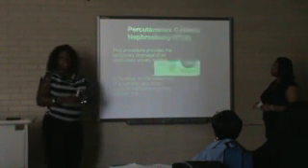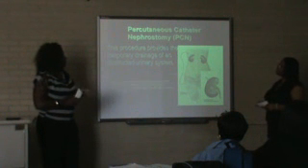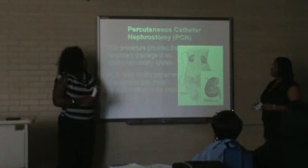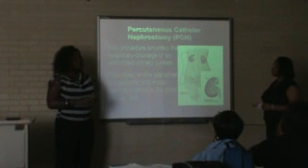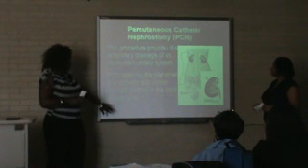Today, the percutaneous catheter drainage technique we'll be speaking on will be percutaneous nephrostomy, better known as PCN. This procedure provides temporary drainage of an obstructed urinary system. It relies on the placement of a catheter, and the trocar cannula method is the most popular one used.